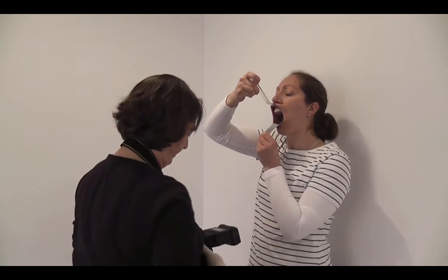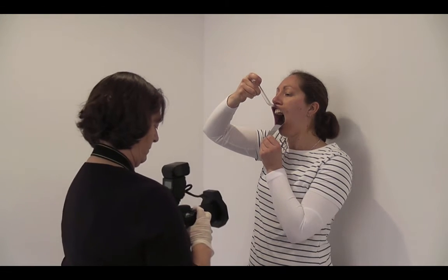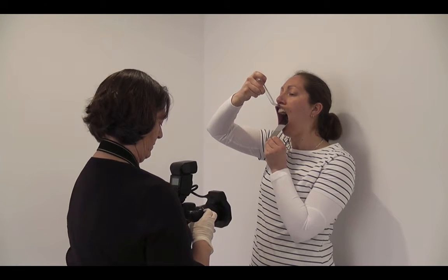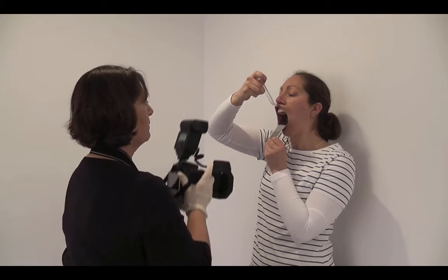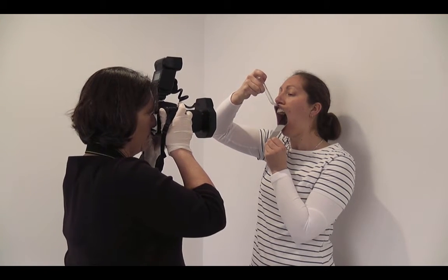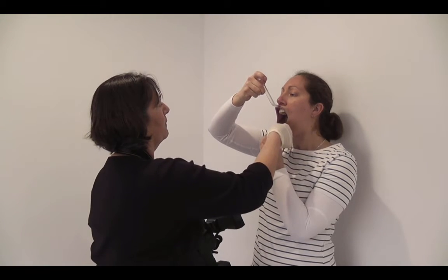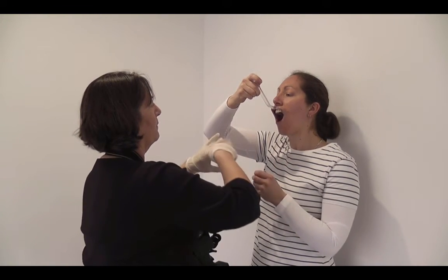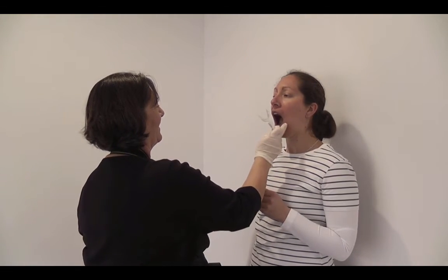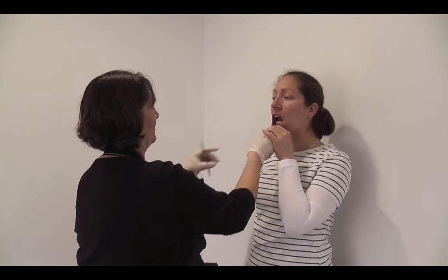The camera needs to be focused on the image in the mirror and include all the teeth. Again, don't tilt the patient's head. The mandibular occlusal photo requires the tongue to be placed behind the mirror if possible, as this will prevent the tongue from blocking the view of the lower teeth.